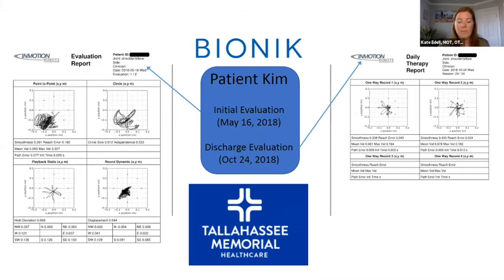Oh, absolutely. Based on her diagnosis and prognosis, the physicians were telling her it's shocking that we see movement at all, and let alone the fact that you were able to relate each metric back to a specific functional task. Like, we needed this for feeding specifically, is so impressive. Sheree, I'll let you jump in and tell us your thoughts based on this report here. And then Sue, if you have, I know this was your patient specifically, what was her reaction and how did you get her to respond to seeing this on the screen?